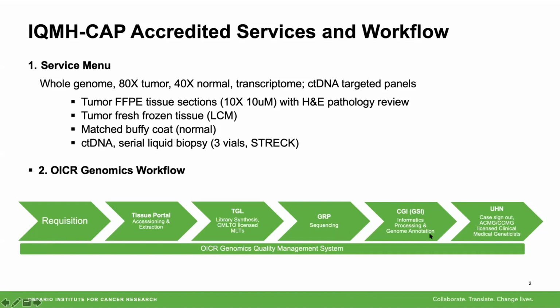After data analysis, it passes to the Cancer Genome Interpreter team for processing and annotation. Finally, we move on to sign out by University Health Network clinical medical geneticists. Next slide.